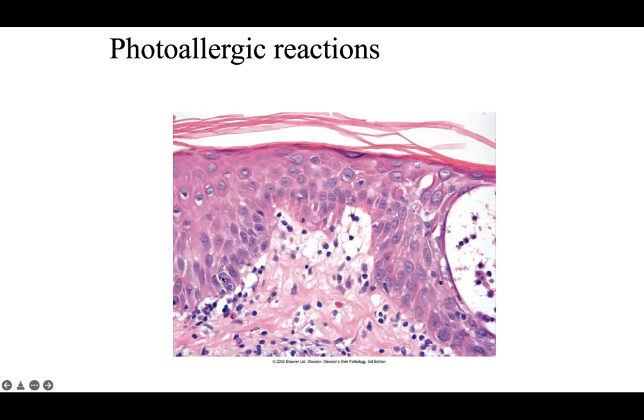So the keratinocytes are going to start putting that melanin on the caps of many different cells. And this is not a great picture to show an example of that, but in entities that are induced by UV irradiation, you're going to be able to see that melanin capping even more diffusely.